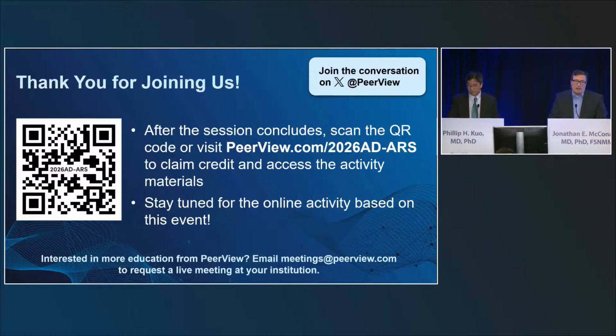Yeah, and I would say most of the software vendors have really designed this around amyloid only. I think that actually leads to some compromises in the way the Centiloids are done. But on the other hand, it really makes it independent of the anatomic imaging. So in general, only in a few problem-solving cases do I think it would be an issue. And those people should have had an MR before coming to you at some point. So at worst, you could recommend correlation with the MR if you don't have it available. But I don't think it changes interpretation in the vast majority of people. I think this next one you could probably handle.